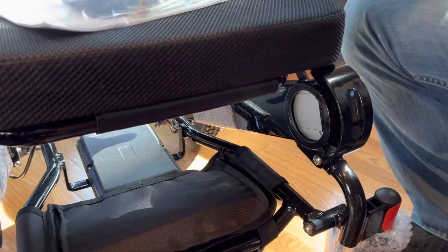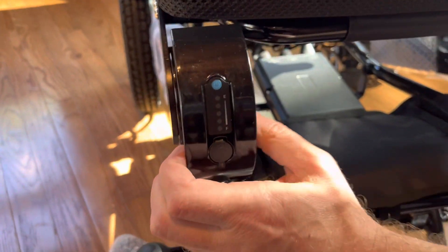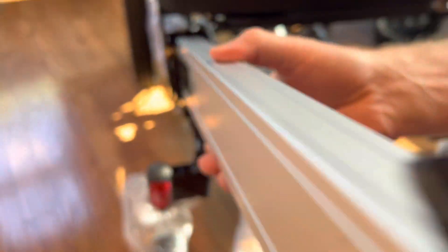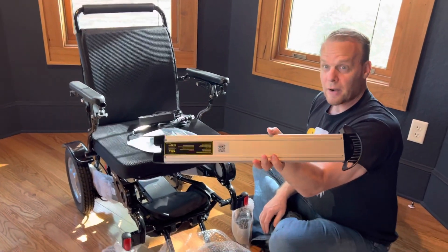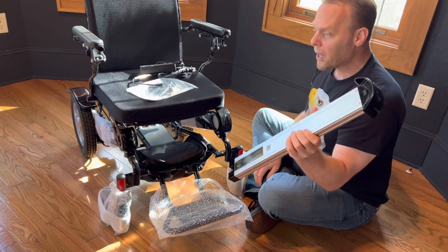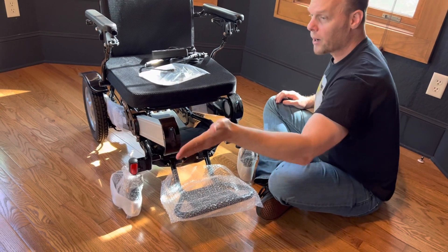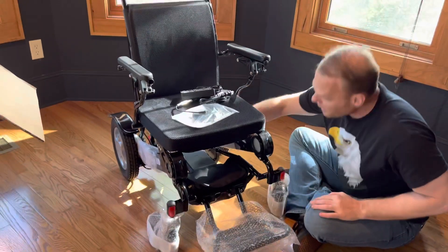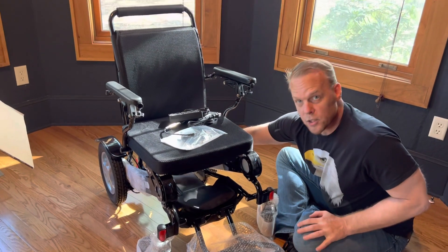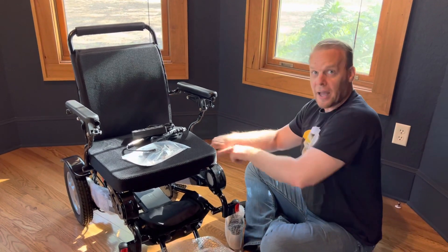One of the other things about this chair — and this is the same with the Falcon and the Electra 7, which is why most people get these chairs — there's a little knob on the inside of the battery. This is the in-frame battery design. These are lithium-ion batteries; they're FAA travel approved. They only weigh four pounds per battery and they're actually convenient to get to. You can be sitting right in the chair and pop the batteries in and out, where a lot of these chairs have batteries underneath — I call it the back breaker design because you literally have to get on your hands and knees to access the battery.